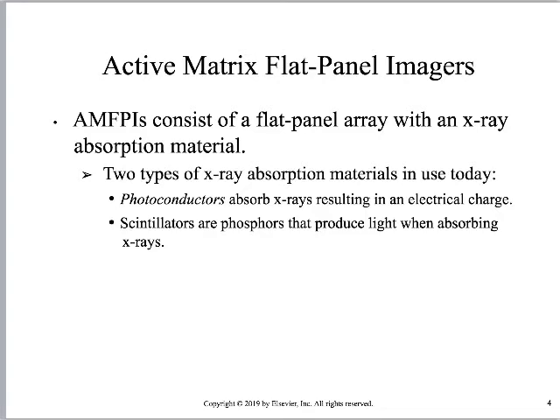So the two big things that we're talking about inside this is that there is going to be a computer part, and then there's an absorption part, right? A computer part and an absorption part. They have different rules that they follow and different expectations out of them. For the most part, if we dropped the detector and we suspect that some part of it is damaged, it is probably the absorption part, right? The computer part, if it's damaged, you're just going to get system error messages.